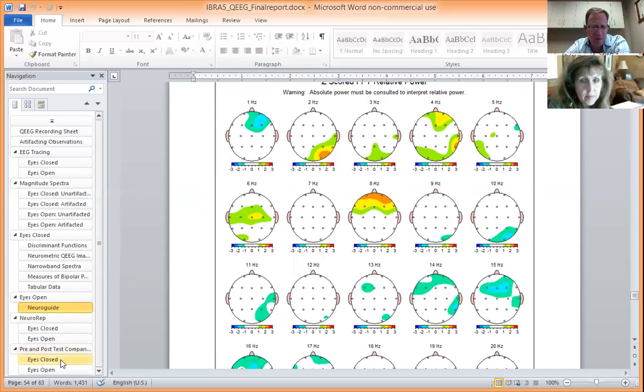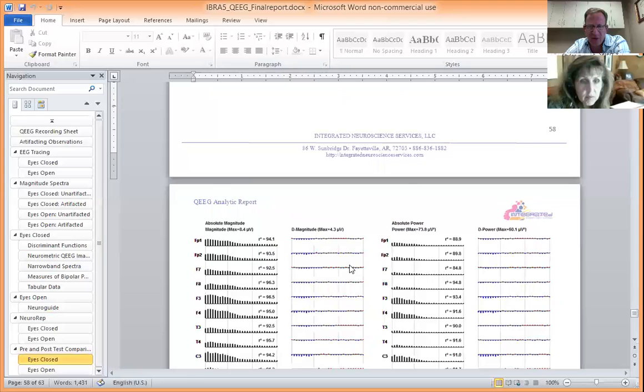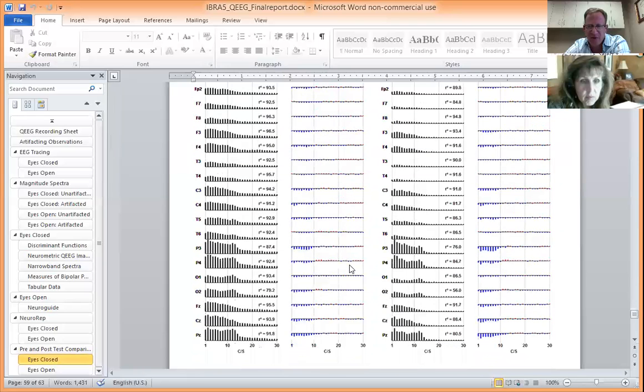Well, on the EEG, when that was done, and you compare these results, it looks like a lot of them have gone down. Oh, interesting. So that power is decreasing. It is decreasing, but it may be over sites that you're not necessarily measuring.